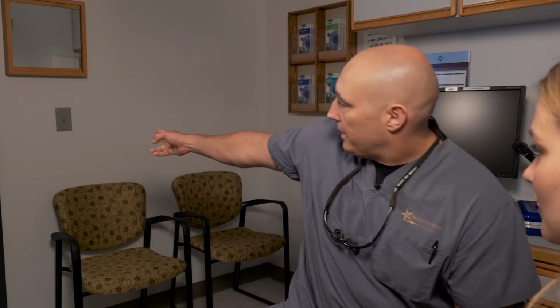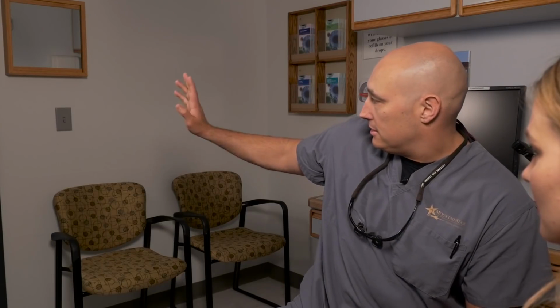So I have a very bright light, I apologize. So I'm going to have the patient focus at distance so that we're not inducing an accommodative reflex and creating pupillary constriction. So the gray light switch, do your best to just stay focused on the gray light switch. Try not to switch to me and focus on the light, okay? So just kind of try to focus on staring off into the distance.